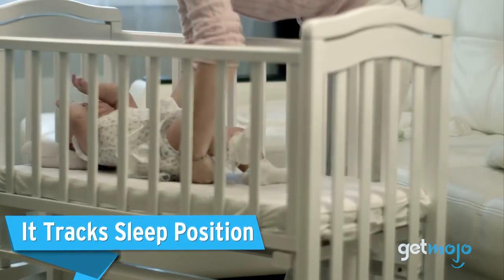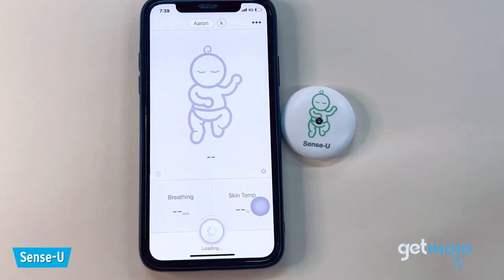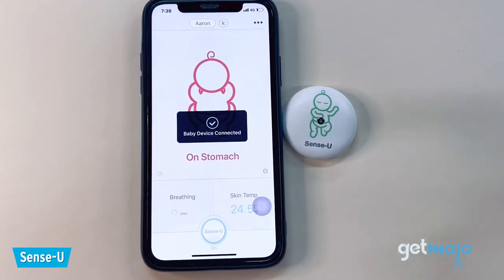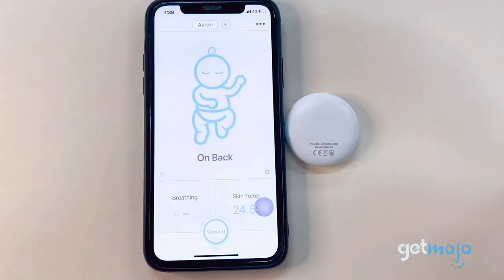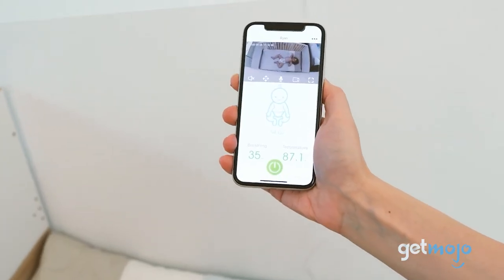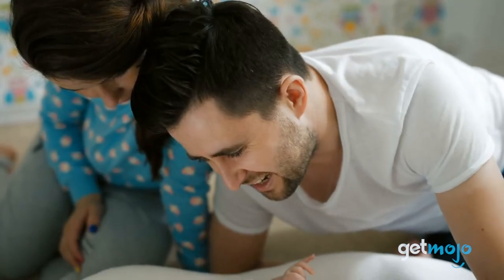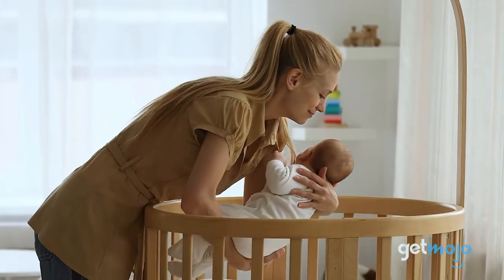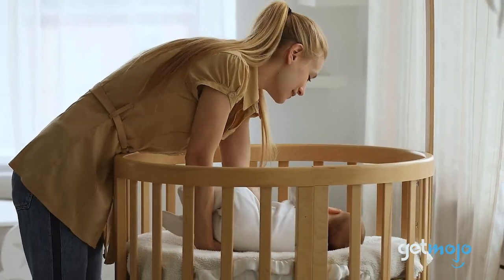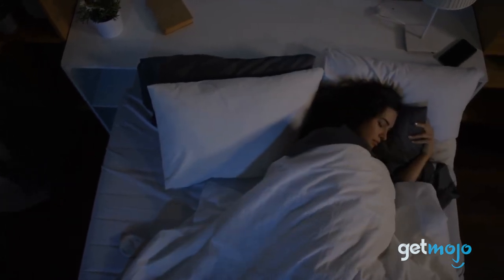It tracks sleep position. The Sensu Baby monitor observes your baby's specific movements, a savior for the sleep-deprived parent repeatedly waking up to check if the baby has shifted positions. What's more, it notifies you if they roll over to sleep on their stomach so you can transfer your newborn to a safer back-sleeping position. With experts recommending that babies sleep on their backs to decrease the risk of SIDS, this distinct tracking feature limits a parent's amount of tossing and turning by alleviating stress.